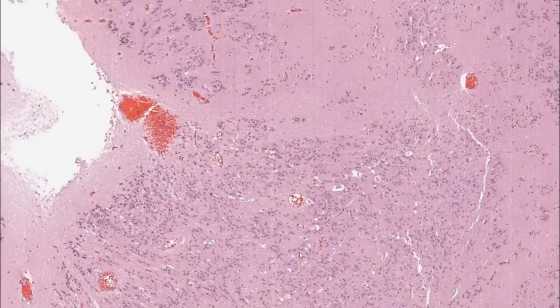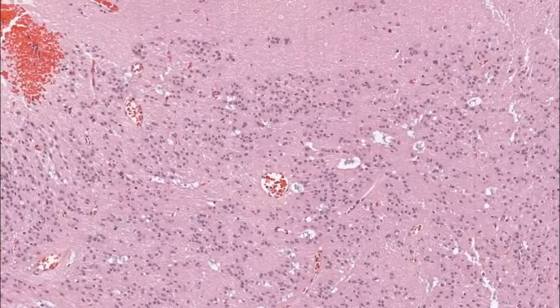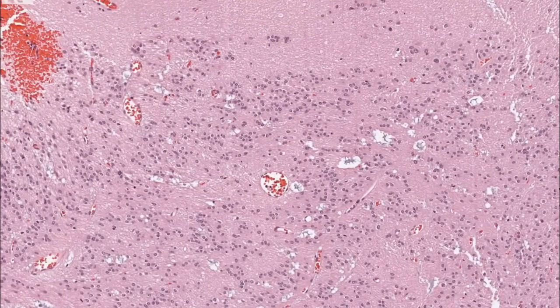A few other features that you occasionally see are these microcysts, and these are more common in the subependymomas that occur in the lateral ventricles. So the ones that are in the lateral ventricles tend to have these microcysts. Some of them occur, of course, in the posterior fossa, and that feature is less represented.